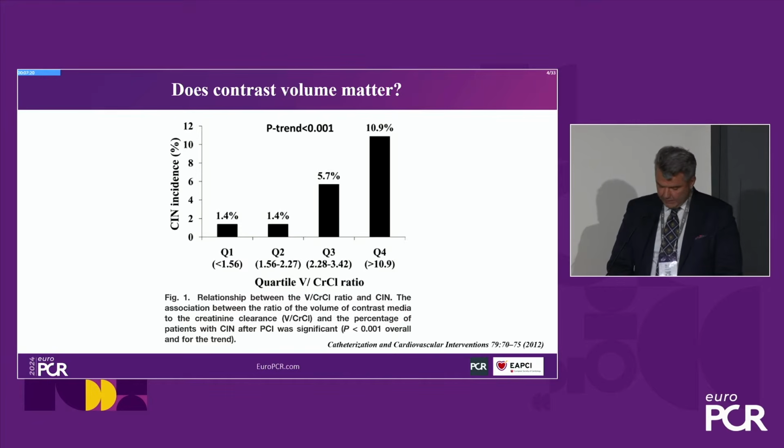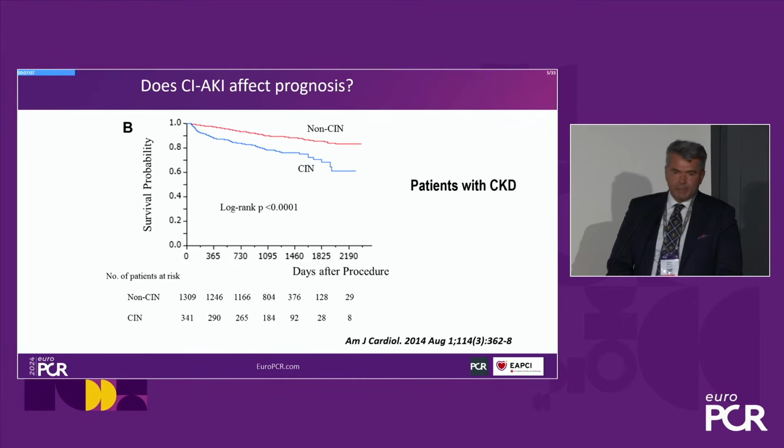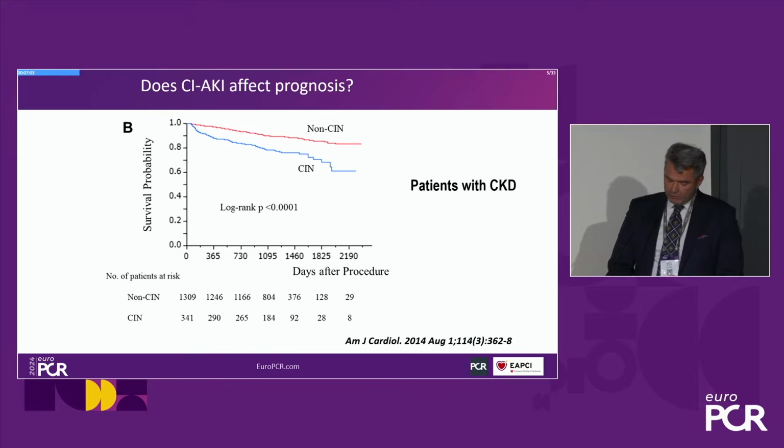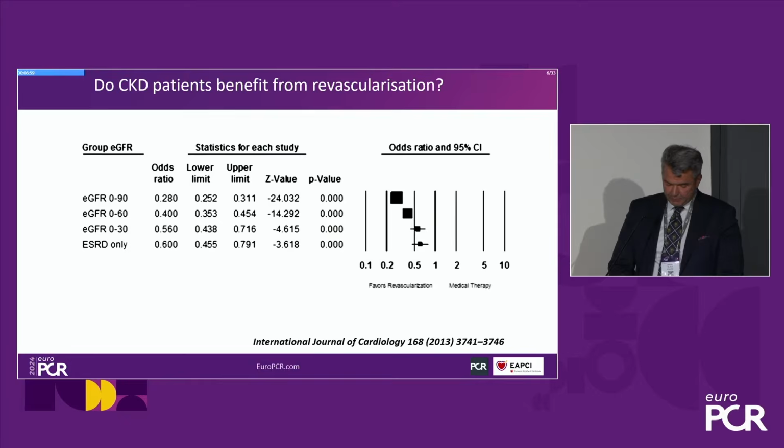Does contrast volume matter? It means that yes, because from the old publications we know that the higher the amount of contrast, the more frequently we can see contrast-induced nephropathy. Moreover, it is impacting the outcome of patients, especially the long term, that if you don't have the problem with contrast-induced nephropathy, you have a better outcome for your patients.